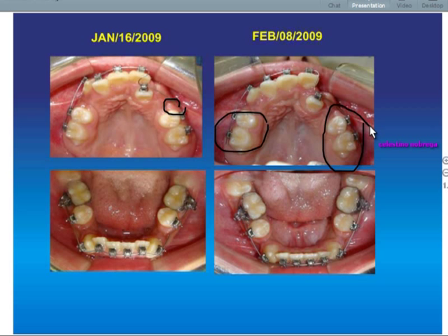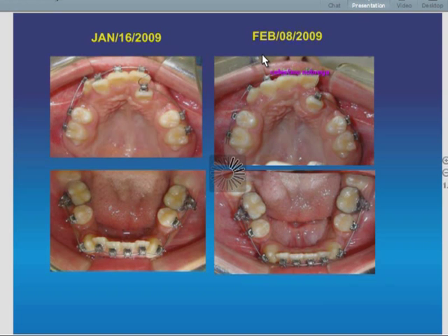And we have a little more friction here. That's why the arch wire is sliding backwards in this situation.